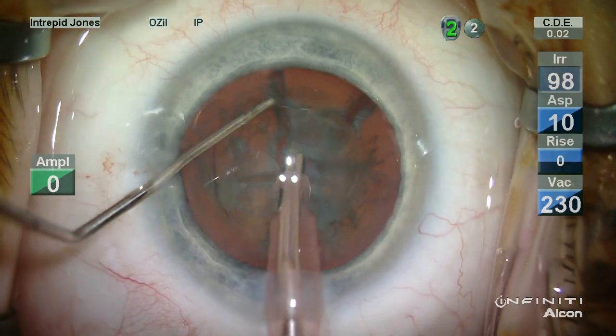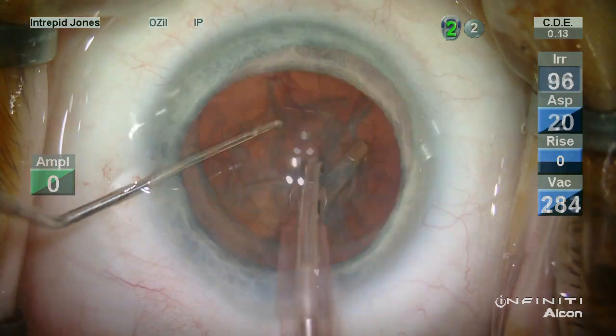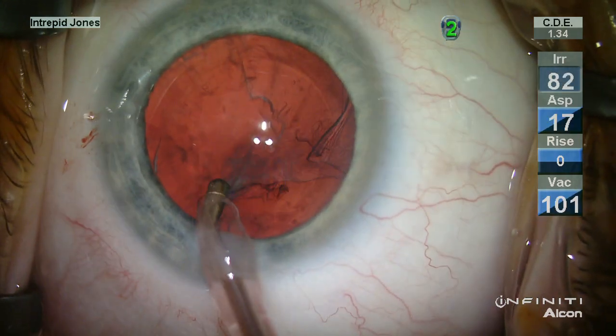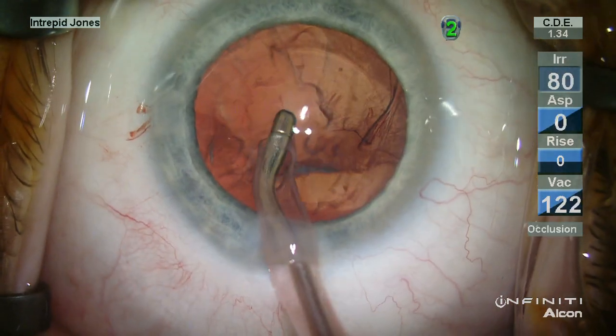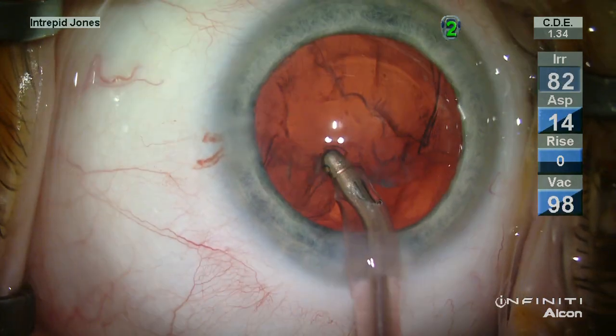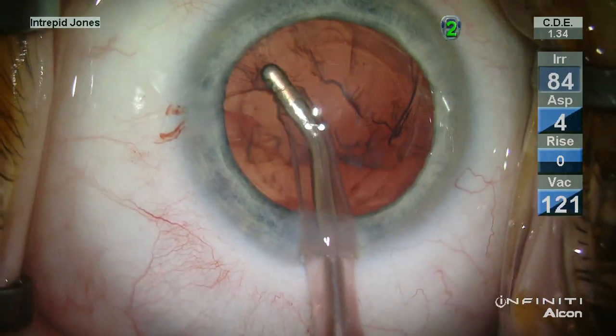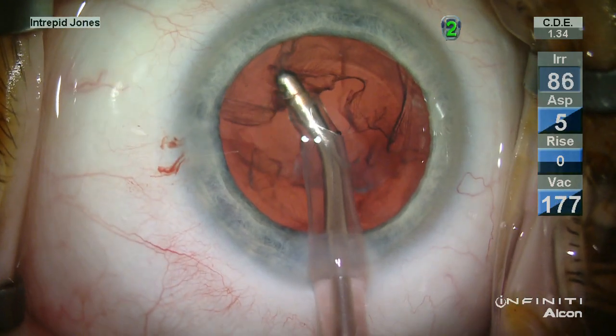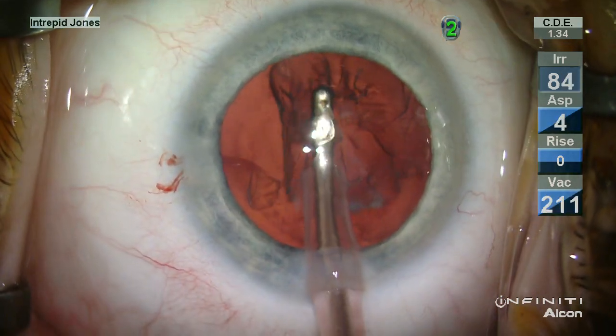These lenses come apart fairly easily with minimal chopping maneuvers. I/A is then carried out in a routine fashion but with care to remove all elements of solid cortex material.